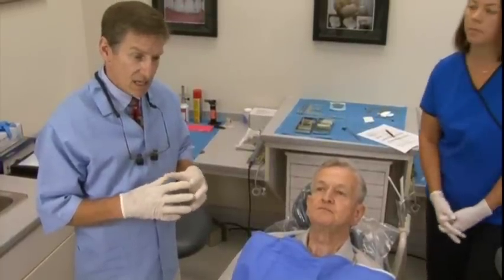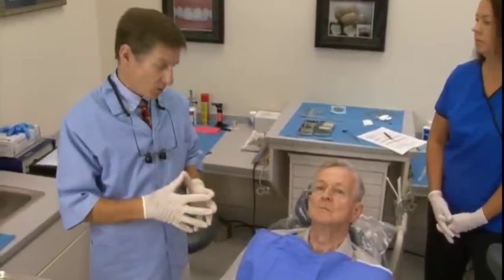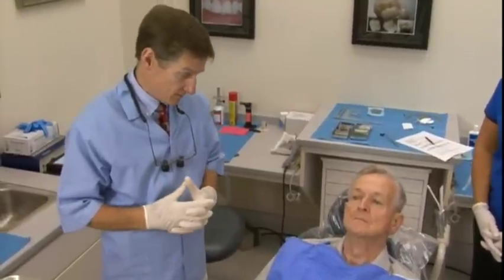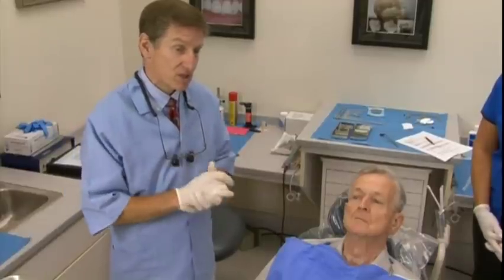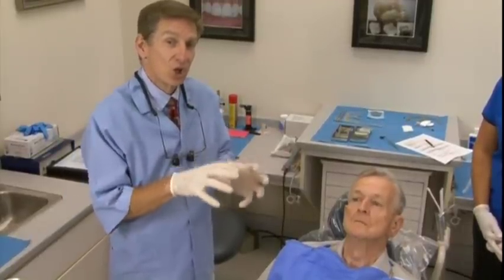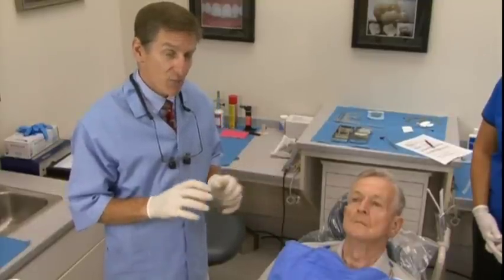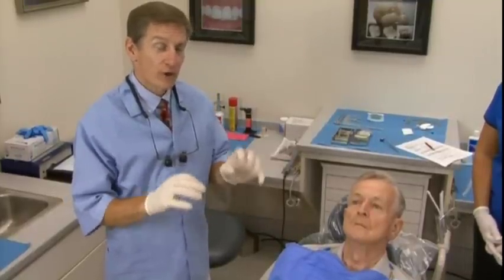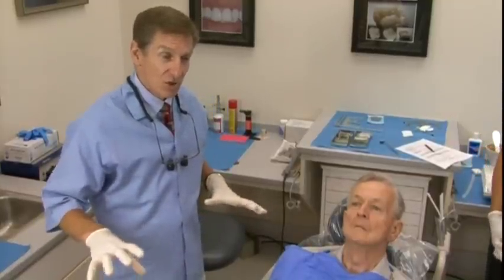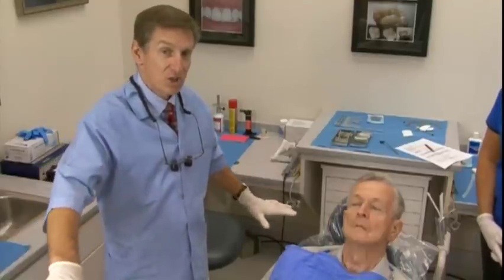We want to go through the process of making some alginate impressions. The model we generate from our alginate impression is the model our approved provisional denture is going to be made on, so this procedure has to be accurate. It's very critical that we get good soft tissue coverage, and we want to overextend our impression to displace as much tissue as we can.